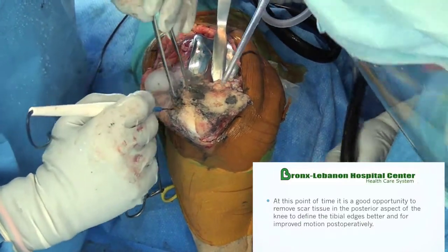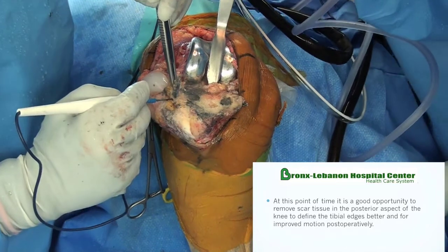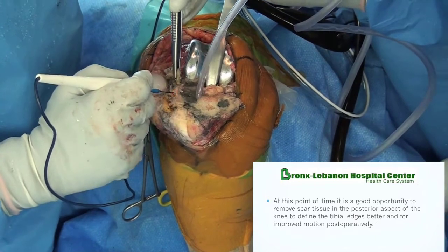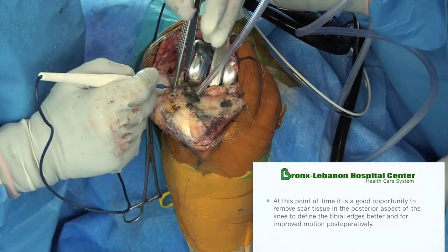At this point in time, is a good opportunity to remove scar tissue in the posterior aspect of the knee to define the tibial edges better and for improved motion postoperatively.